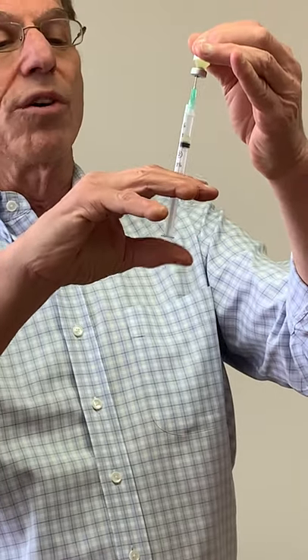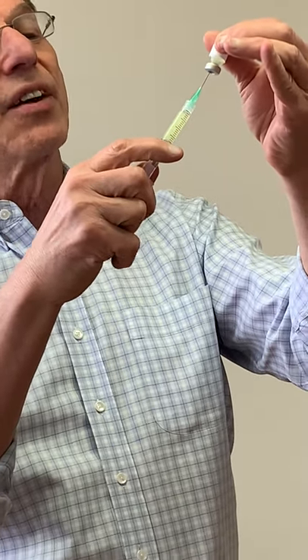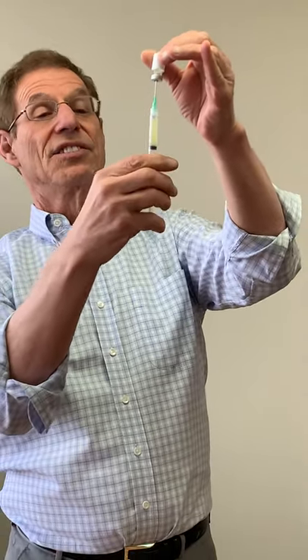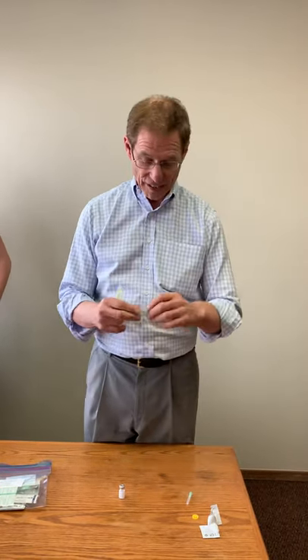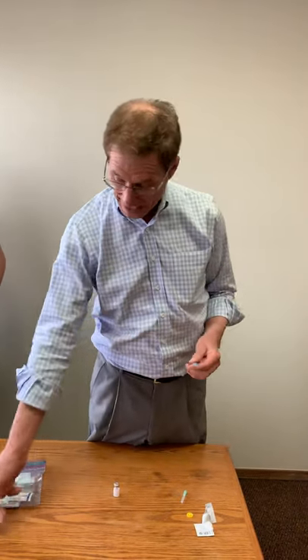I go back and forth, take a little out like that, make sure the needle is right at the very tip, and then I have everything out from the vial. Then we replace the needle with the smaller one, going from the 21 gauge to the 25 gauge.